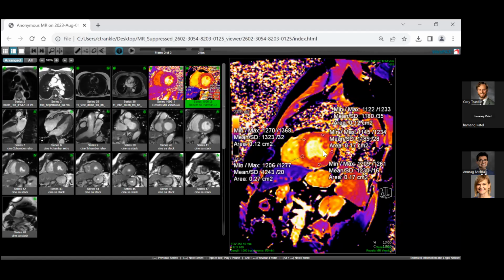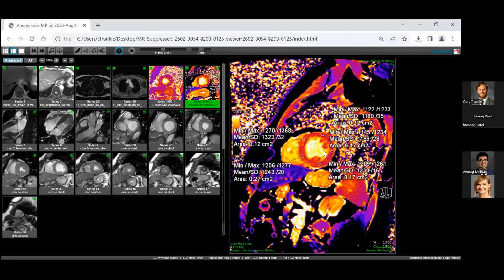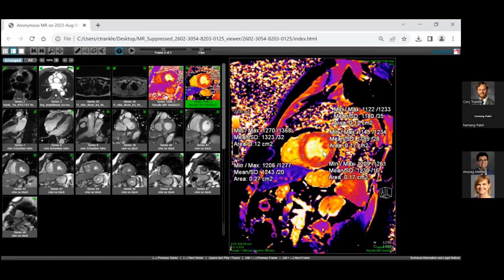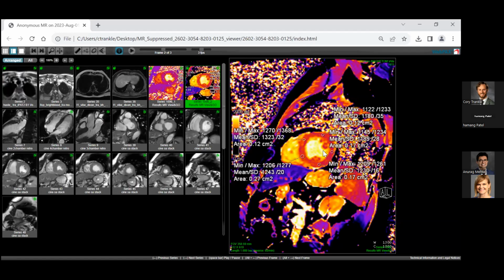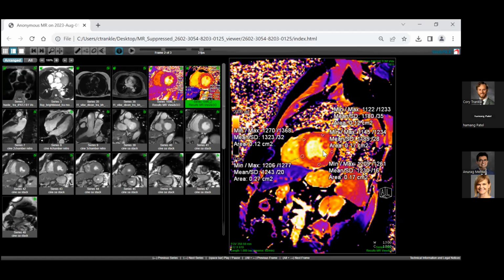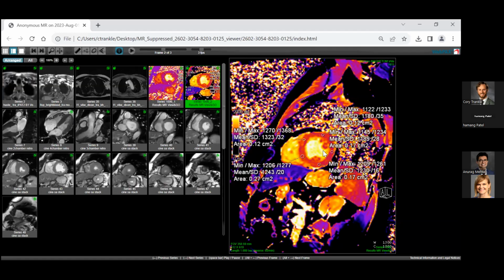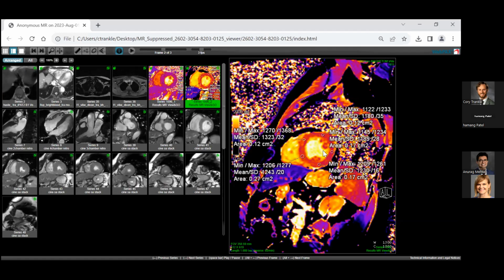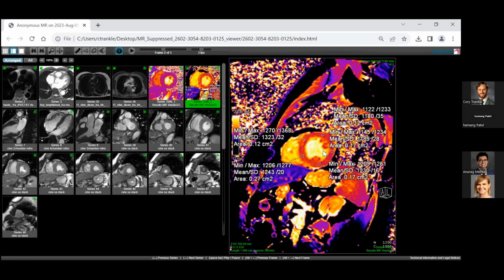Amyloid. If we get another invasive protein in that space, your T1 becomes elevated; something is wrong with that ratio. And it's kind of easy to remember. At age 20, it's about 20% extracellular stuff and 80% is myocytes. As we get older, that ratio changes. If we've got comorbidities, lots of hypertension or diabetes, it varies because fibrous tissue can get in there, stuff like that.